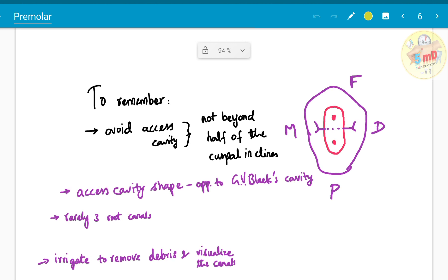This is the takeaway point to remember. It is the ovoid access cavity and it is opposite to the GV Black's cavity shape. Not beyond half of the cuspal inclines. This is the cusp. Not beyond half of the cuspal inclines. Don't make a very huge access opening in search of canals. The canals are straight away below the cusps. The access cavity should not extend beyond the half of the cuspal inclines.